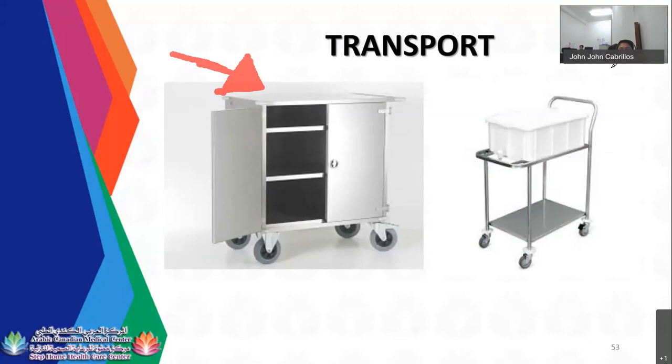Well, for this one, for example, this is your open. This is your closed. Sometimes they are placing it here with a dust cover. Then it is prone to contamination. Vulnerable to contamination. So the open cart is vulnerable to contamination.